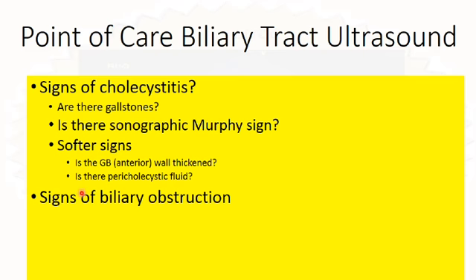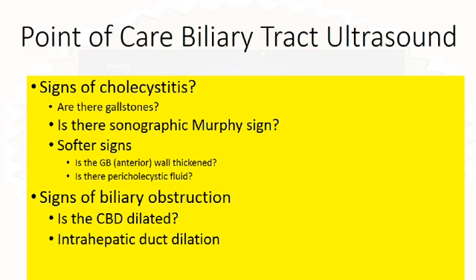Okay. Biliary obstruction: is the CBD dilated, the common bile duct dilated? That is the main thing. Okay, and in some instances, are the intrahepatic bile ducts dilated?